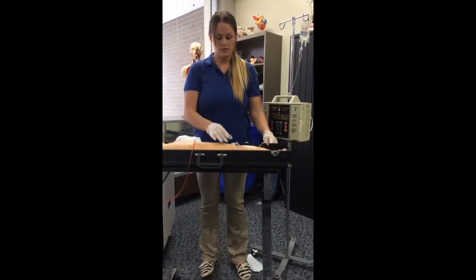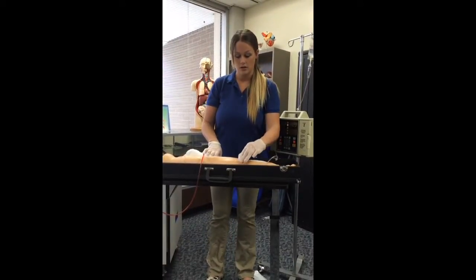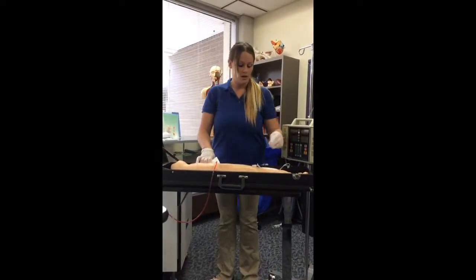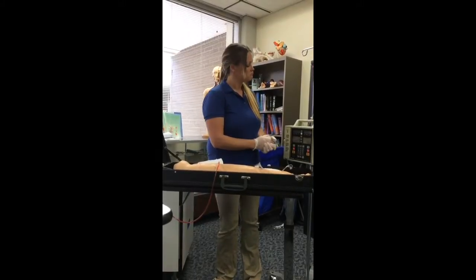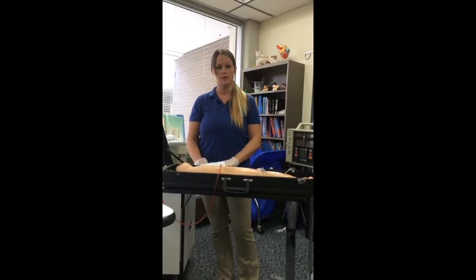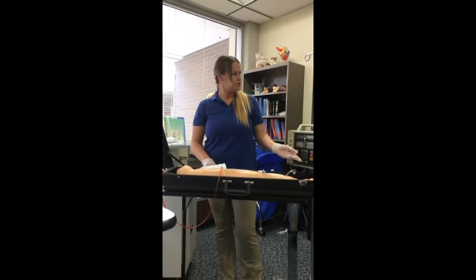Now I'm going to inspect to make sure that there's no redness or swelling or irritation. I'm going to ask the patient the 4 Ps, make sure he's comfortable. Then I'm going to leave the room and tell the patient I'll be back in an hour. And when I come back in an hour, the medication should be over with.